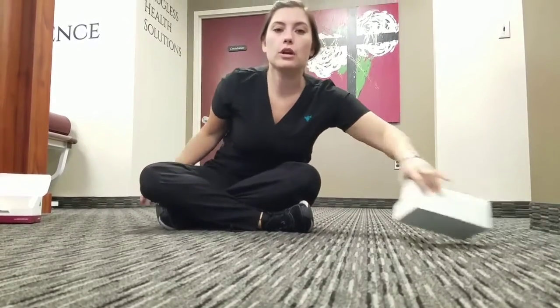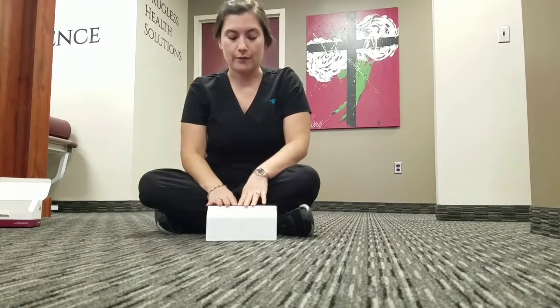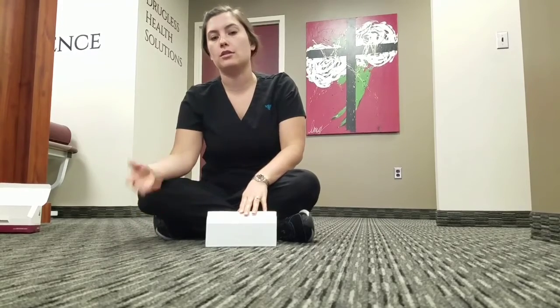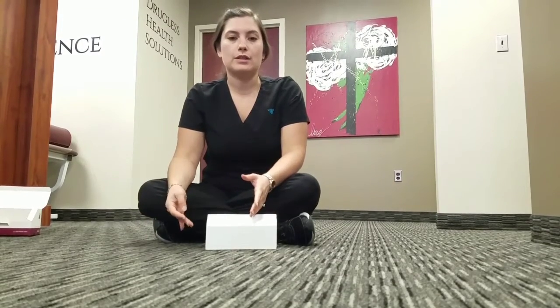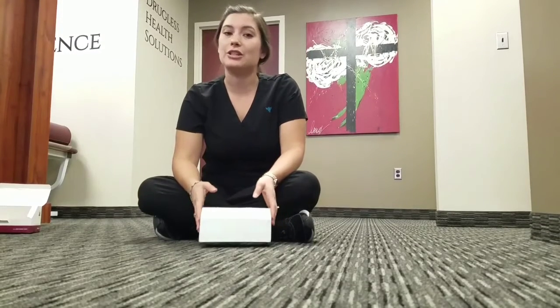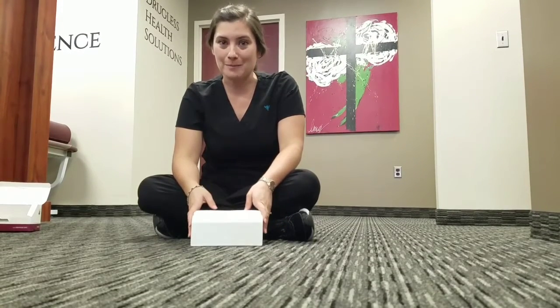And then, like I said, you're going to make sure that you do this on the floor. You're going to make sure that after you do it each time, if you're sore, you stay at the same length of time for the next time until you're not sore anymore. If you don't have any soreness, you're going to go up by 30 seconds. If you have any questions, please ask your doctor because they would be more than happy to help.